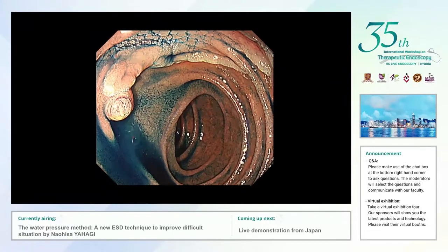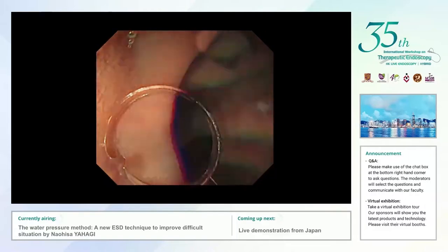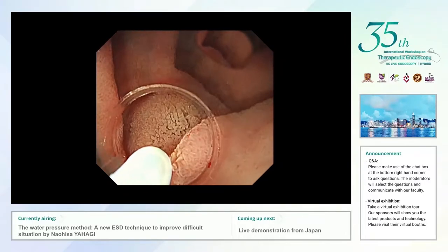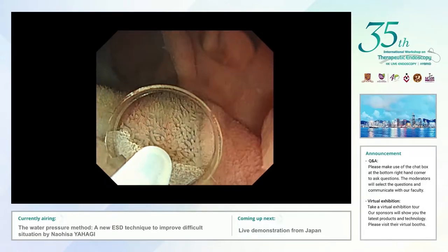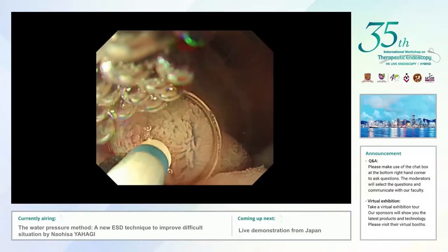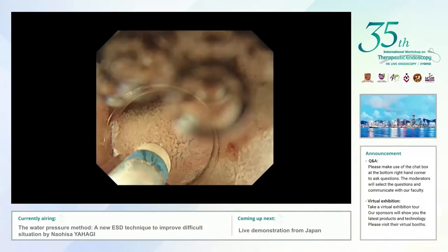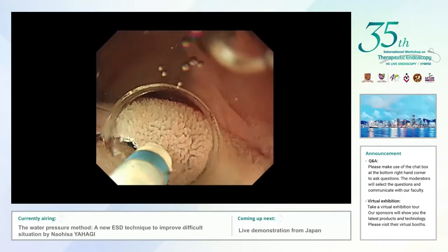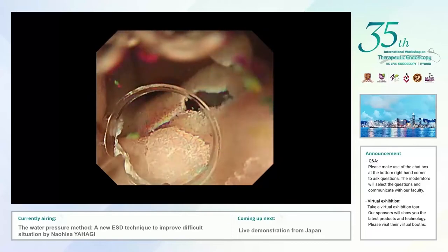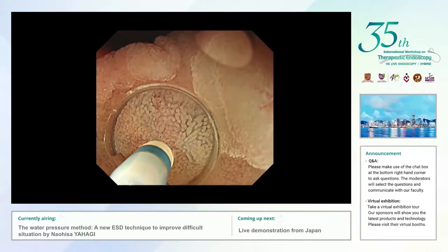I carefully checked the maneuverability of the endoscope. It was relatively smooth but very difficult to control the direction. Therefore, I decided to rotate the endoscope to place the target region at the 6 o'clock side and started the injection from the anal side using Glyceol solution. Using the Dual knife and dry cut mode, I started the mucosal incision carefully from the left side to the anal side. By torquing my wrist and using the right-left channel, I could make a relatively smooth mucosal incision.